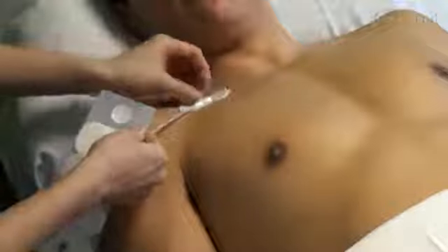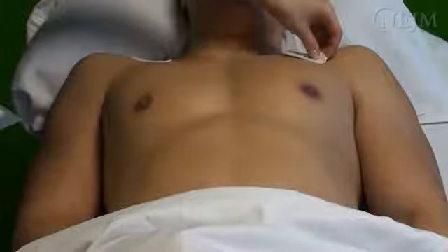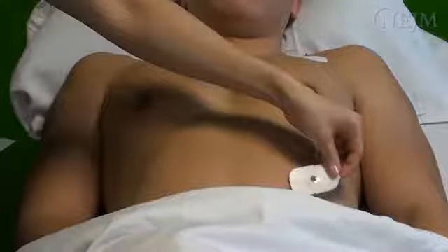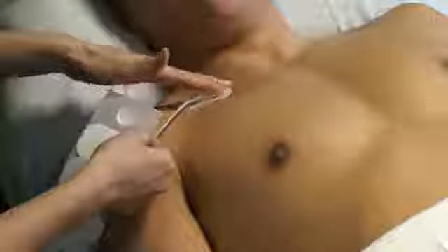Place the electrodes with gentle downward pressure. To minimize the appearance of artifacts in the ECG, avoid bony prominences and major muscle groups when selecting sites for electrodes. If you are using snap-on lead wires, attach the lead wires to the electrodes before placing the electrodes on the patient's skin.